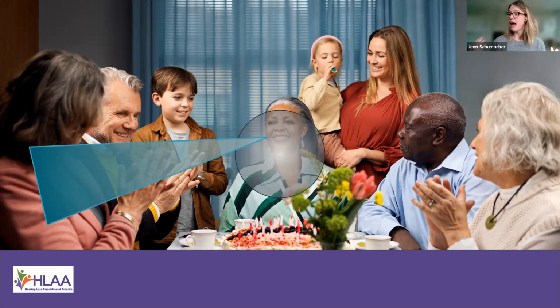But what about if someone behind her starts talking? What if the little girl starts singing happy birthday, or wants to ask her a question, or a friend to her side, or someone new comes walking into the room? Believe it or not, when we're talking in multi-person groups, most of the time we're looking at somebody when we want to talk to them. But up to 30% of the time, we actually don't want to listen to who's directly in front of us. We also want to pay attention to things going on behind us.